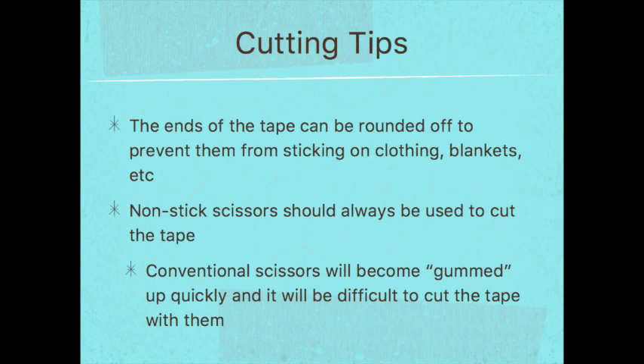Here are some general tips on cutting the tape. We can round the edges, which you'll see in the videos. The reason to round the edges is to prevent the tape from sticking on clothing, a blanket you might put on a horse, or anything a dog might rub against — it helps decrease the chance of the tape coming off. You'll also want to use non-stick scissors because conventional scissors will become gummed up quickly. Non-stick or Teflon-coated scissors can be found in the craft department of most stores.